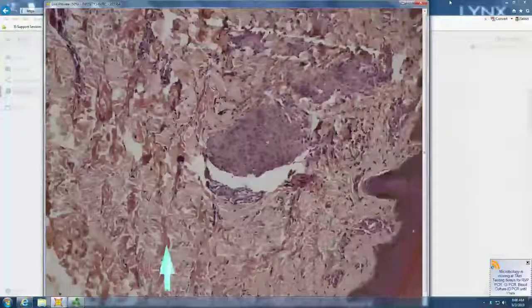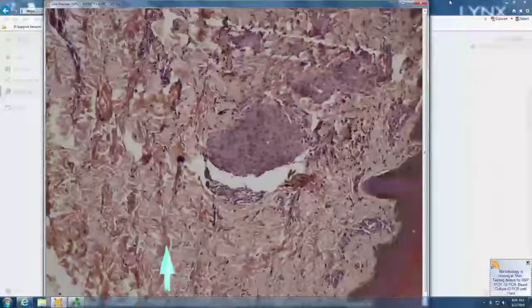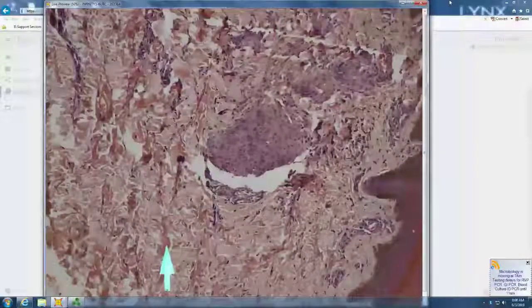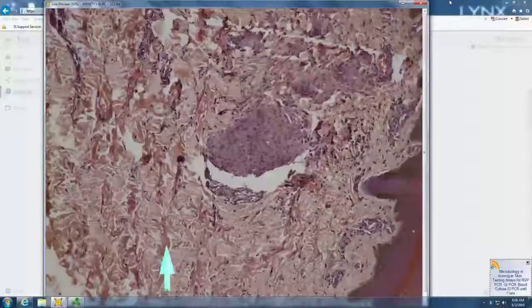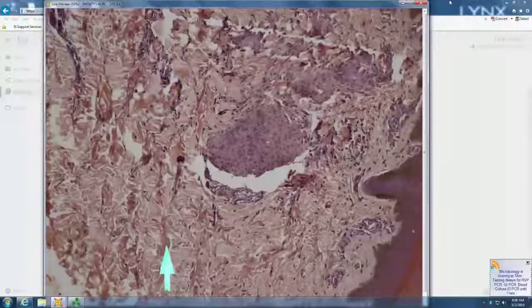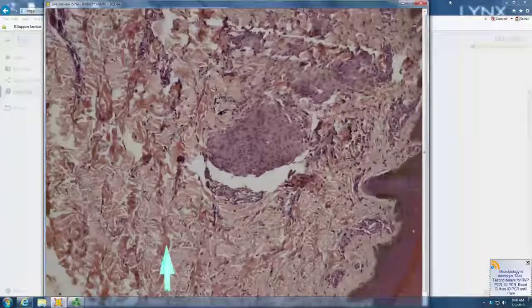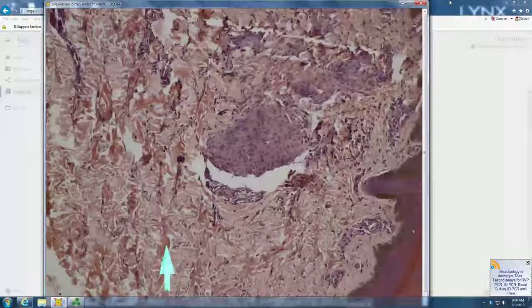So so-called tuberculoid will tend to have lymphocytes, but leprosy sometimes can be as naked as sarcoidosis. They tend to be more horizontally oriented following neurovascular bundles. So sarcoidosis, cutaneous Crohn's, beryllium and zirconium granulomas, all can be naked granulomas in skin.